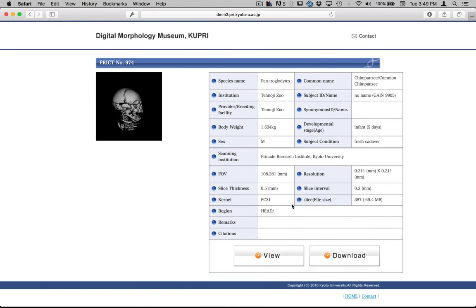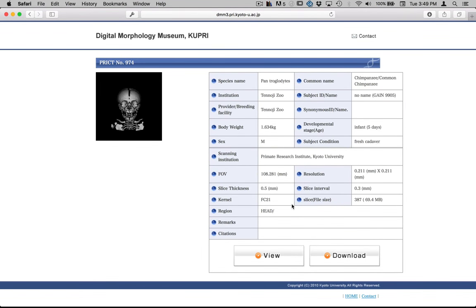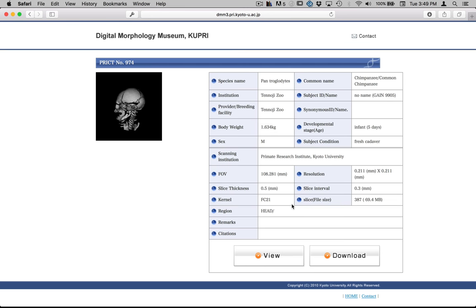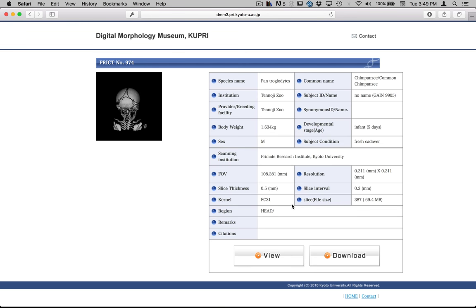In this last assignment we'll be working with DICOM images. These are images derived from medical imaging techniques like CT scanning. And these have been downloaded from, in this case, the Digital Morphology Museum. This is in Kyoto, Japan.